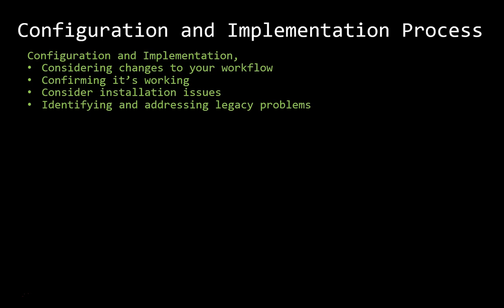The SWF profile ensures that patient demographics and order and procedural information are correct and consistent throughout the enterprise. They must consistently be entered from the same system, whether it's the HIS or some other system, so the responsible system can maintain and appropriately distribute the information to all interested systems. Clinical and IT personnel will need to identify the owners of certain information elements. The owners distribute the information while receivers track it.